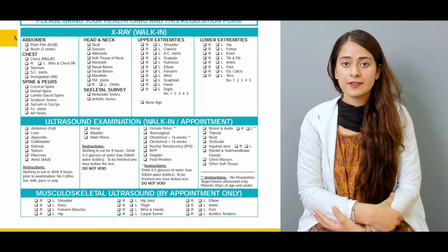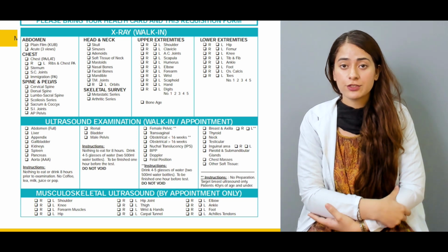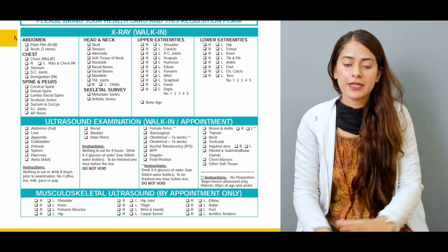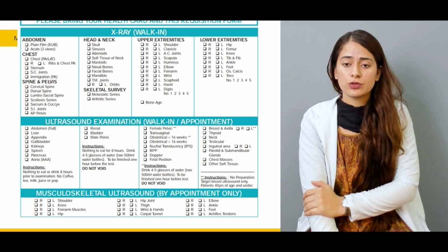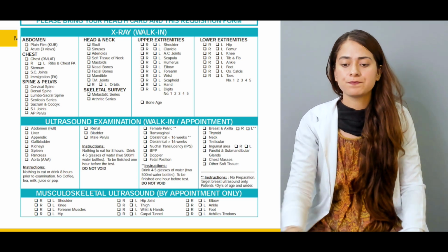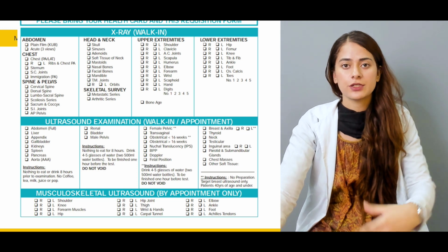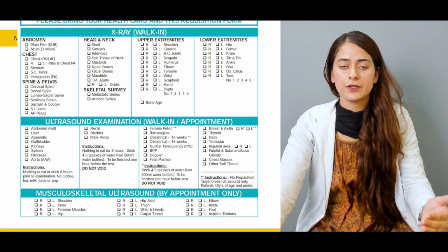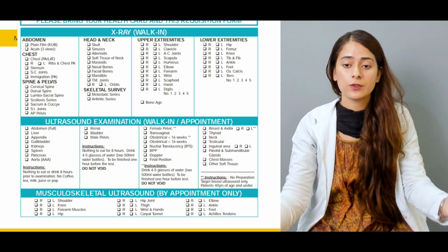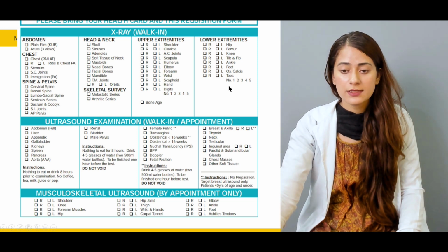So if you are expecting, for example, a fracture in the right arm, it is better to ask for an X-ray of the left arm as well, just for a comparative analysis, because there are sometimes hairline fractures and some other sorts of abnormalities, some deformities, which can be ruled out if the two extremities are compared.